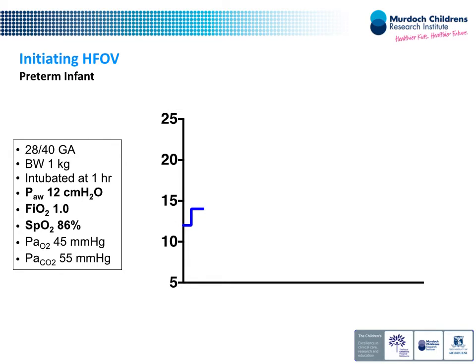I'm going to put it to you that X-ray is actually not a very good way of delineating fine changes in lung volume. We talked about this in Calgary. There's actually, at least in high frequency, very few studies on the ability of X-ray, despite us using it ubiquitously. Right? And I think there's only 2. I know of one in detail, and it showed a very poor correlation between absolute lung volume and single measures on X-ray, such as counting the ribs and lucency of the lung. They got better if you combined all of them together.